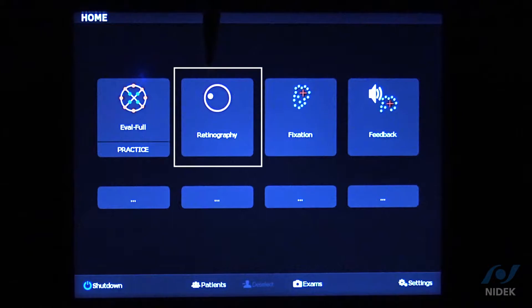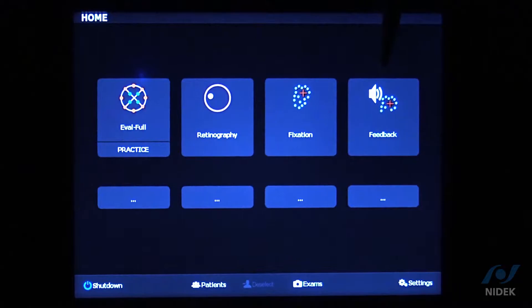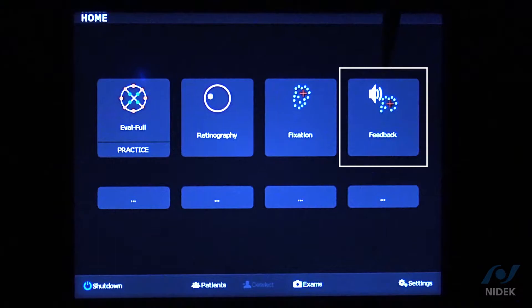If you just want to utilize the MP3 as just a retinographer, you can click on this icon for color retinography only. Or if you want to track the patient's fixation to see if it's stable, relatively unstable, or unstable, we also have our biofeedback rehabilitation program.